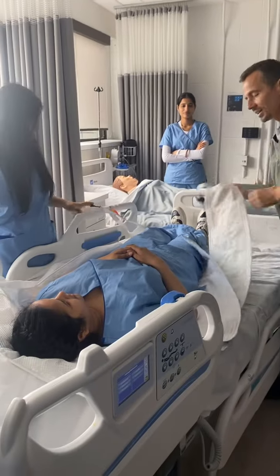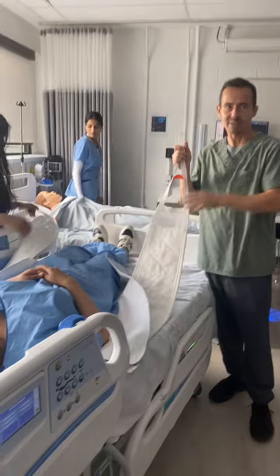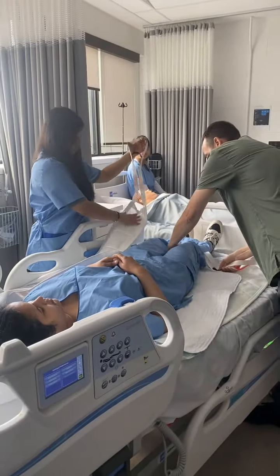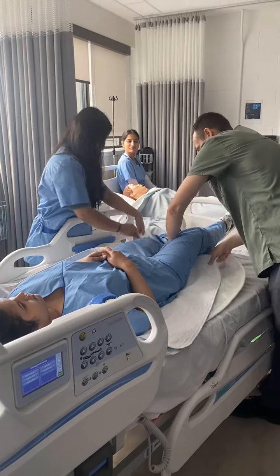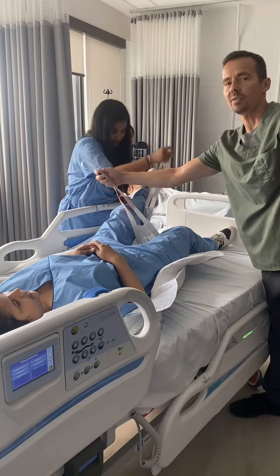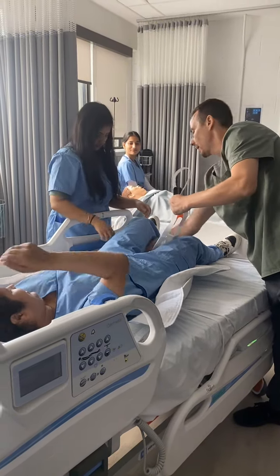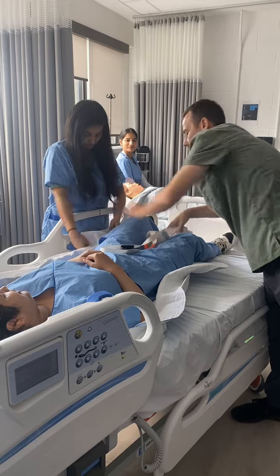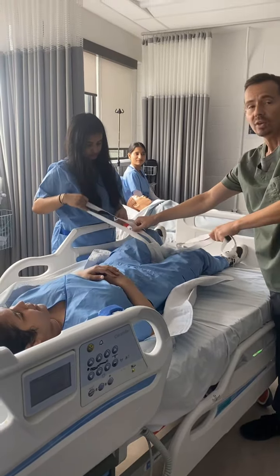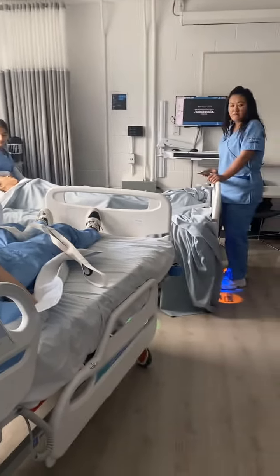So the legs of the sling, I'm going to call them legs, I'm not sure if that's the right term, but the extensions of the sling, they go underneath the legs and they cross. So this hook goes on the opposite side, and this is the abdomen. And this hook goes on the other side. So now you have the legs crossed. You can do that completely on your own. You don't need a second person.